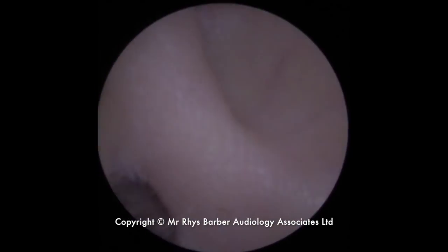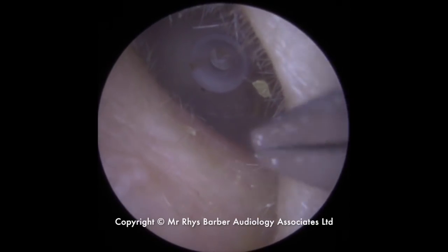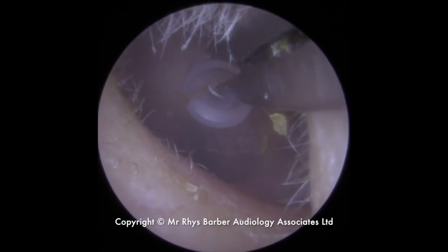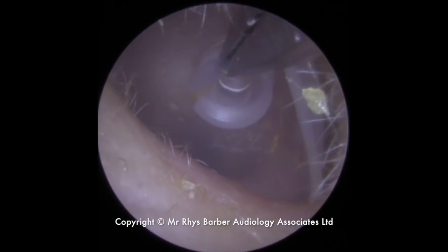This is what they call a dome — you can see it blocking the ear canal up there. This is a little rubber silicon tip that fits on the end of what they call a receiver in the ear hearing aid. It's got a little collar in the centre of it, so we're going to use the crocodile forceps to get a grip on this collar and bring this out, just pinching on it there.